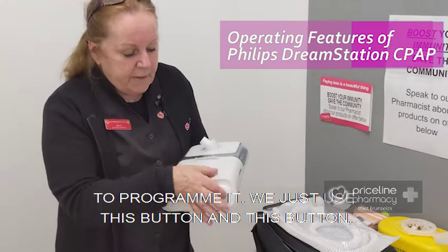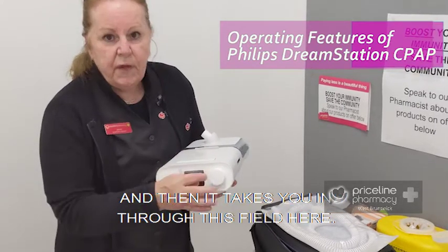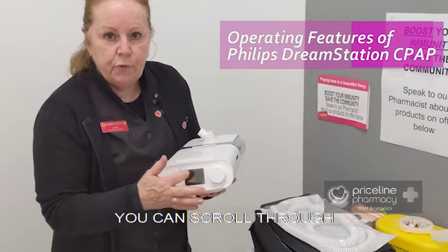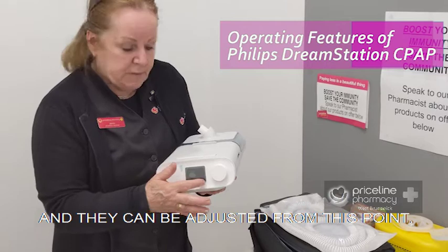To program it we just use this button and this button, and then it takes you in through this field here and you can scroll through and have a look at all of the different functions on the CPAP, and they can be adjusted from this point.